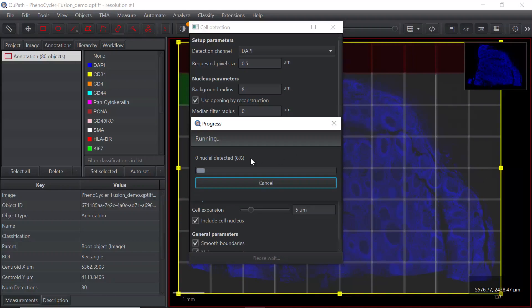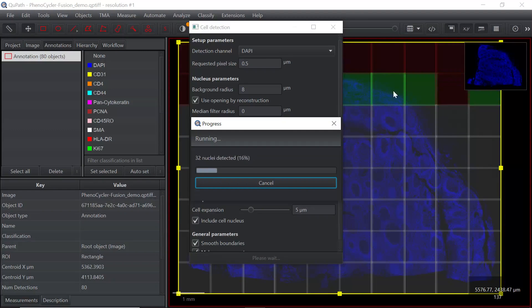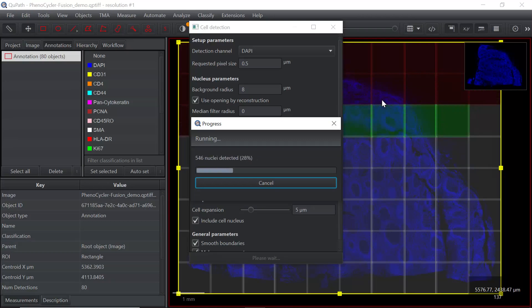You can see the program is running. It goes through the whole image and detects cells in small pieces. It will take several minutes to finish. While it is running, you cannot perform other analyses.